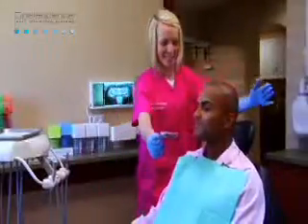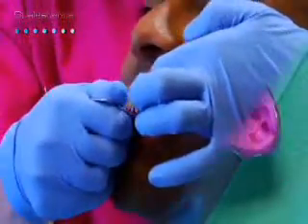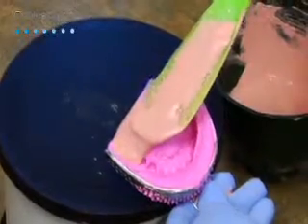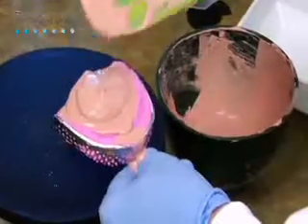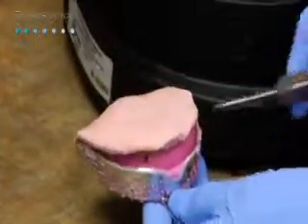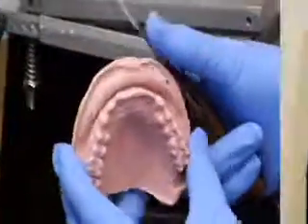The first step in fabricating custom trays for whitening is to take an alginate impression of the patient's upper and lower arches. Fabricate the tray by pouring the alginate impression with fast-set plaster or dental stone. To ensure accuracy, do it shortly after making the impression. When fabricating, remember to have enough mass to remove the model from the impression without breaking it.